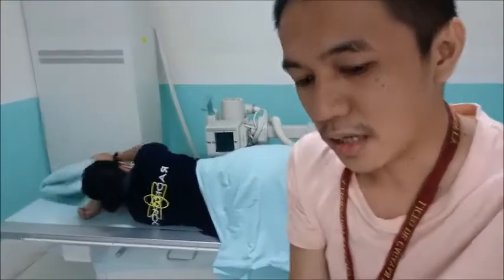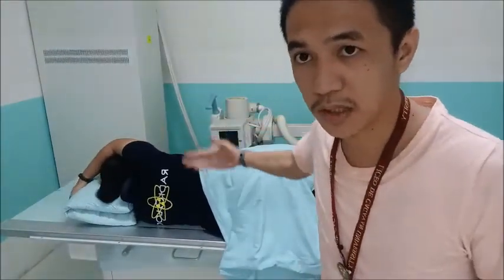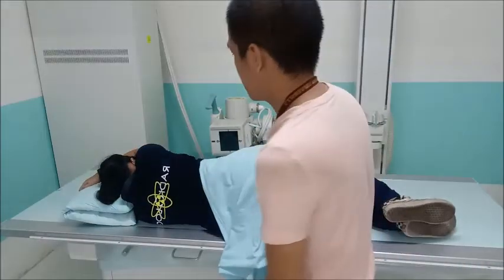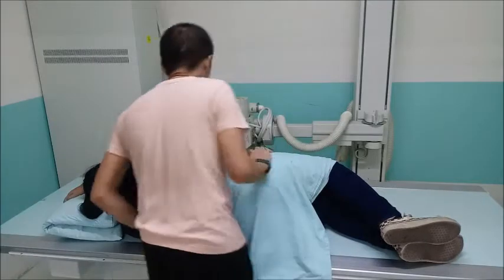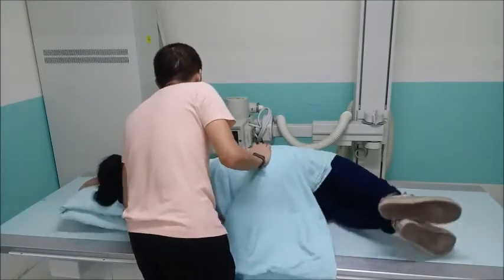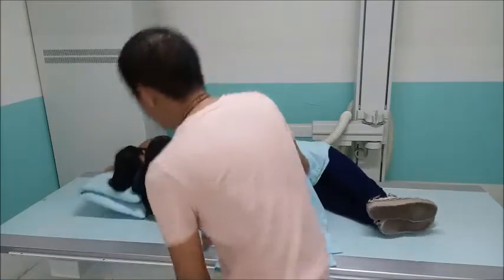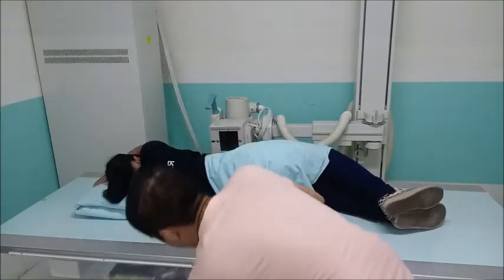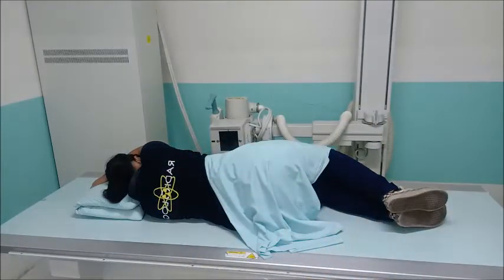Okay? So for the IR, the X-ray tube is here, so the IR should be placed opposite our X-ray tube. Forward. Forward now. Okay.